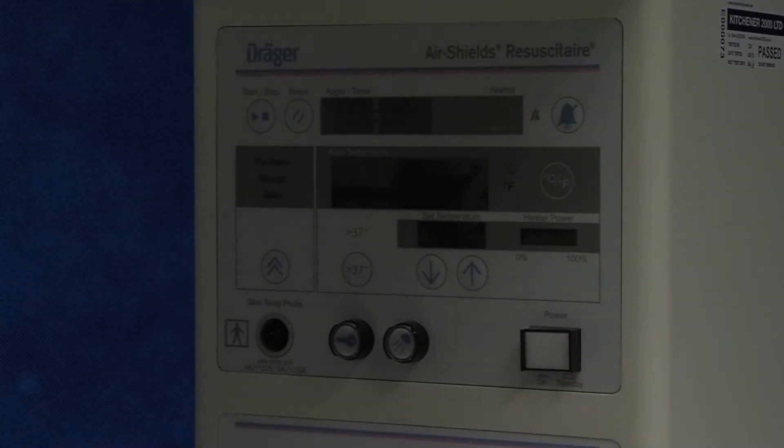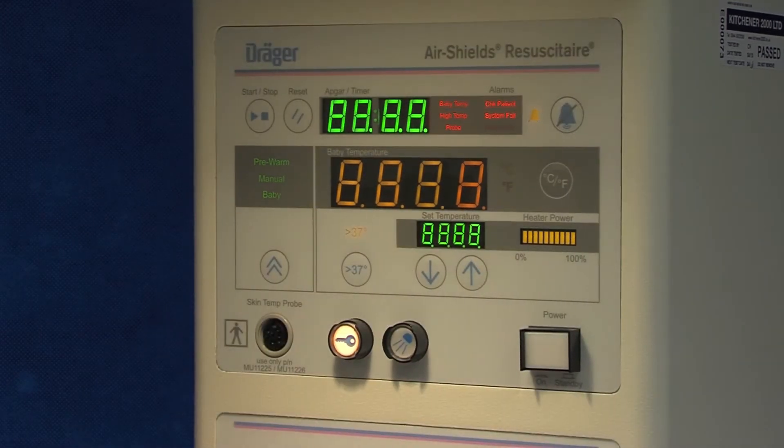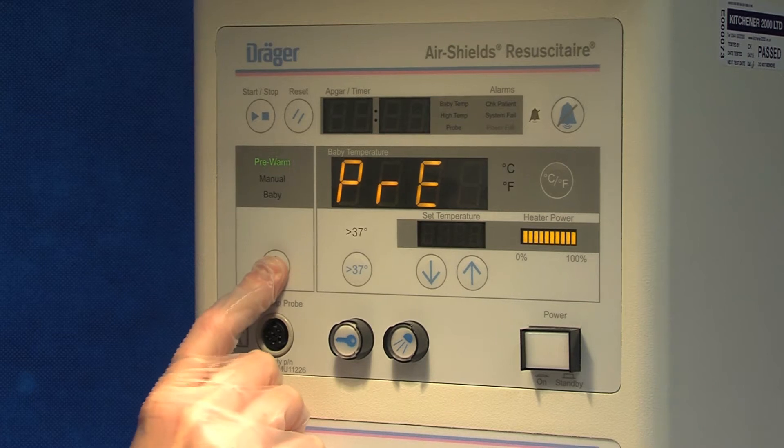In order to provide effective neonatal resuscitation, it is paramount that you check the equipment is working. Switch on the resuscitaire, turn on the light and make sure you have adequate heat. You can see on the dial how you can adjust the heat power accordingly.